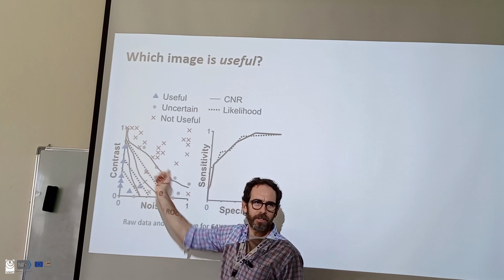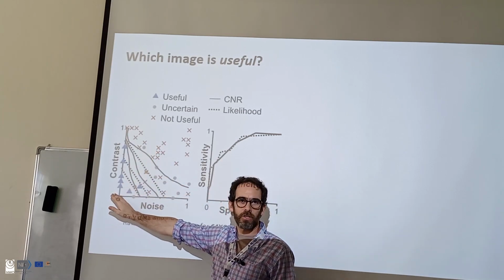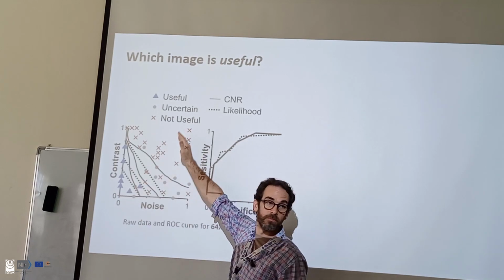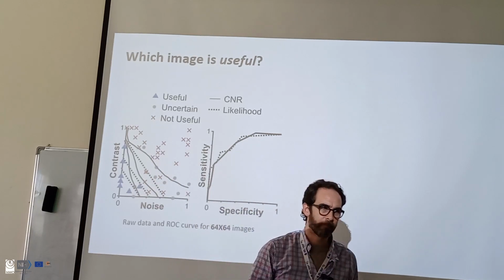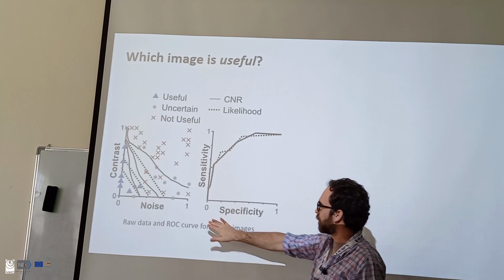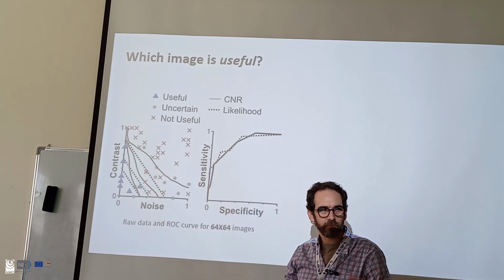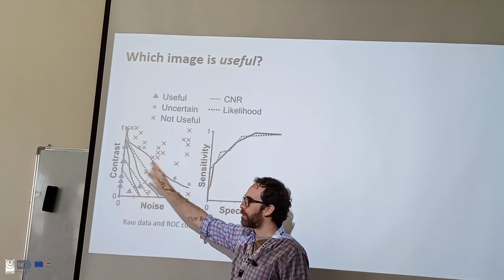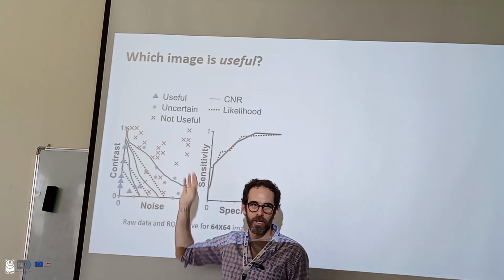And it sort of matches up with what you might expect. The less noise and less contrast reduction you have, the more good images you have, and as you get further into the noise and the contrast reduction, you have bad images. I should also say, I didn't mention this before, but I chose which points to apply to the images completely at random. So of course we didn't cover all points in space. Can't do that. But I used an algorithm to randomly choose the noise and the contrast for each resolution.